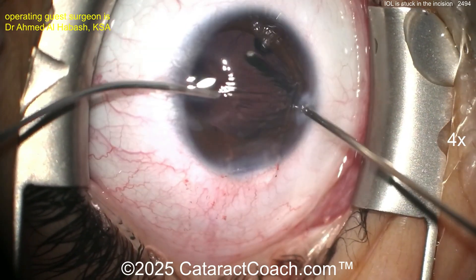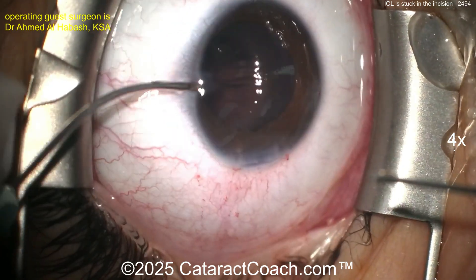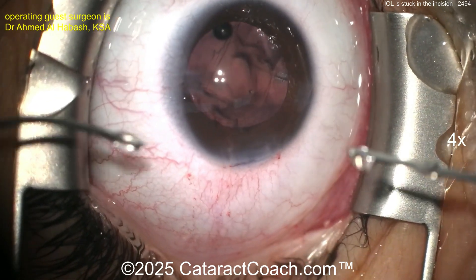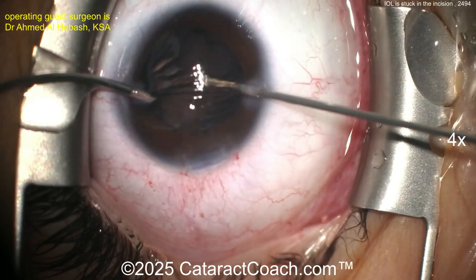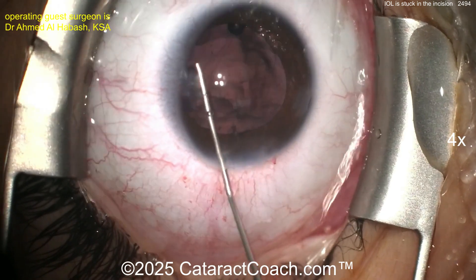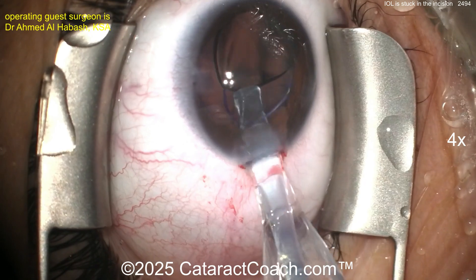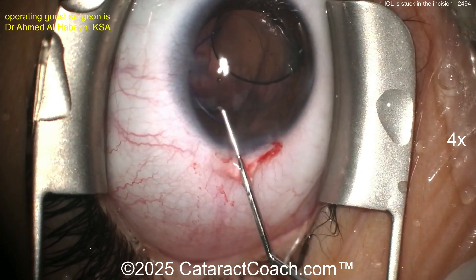Cleaning up the prolapsed vitreous should be relatively straightforward. I'd say putting in a three-piece lens is your best bet — put the haptics in the sulcus and do optic capture. You've got a beautiful capsule rhexis, so that's the saving grace here. Take your time. Triamcinolone is really helpful here to stain any vitreous and confirm there's none left in the anterior segment. Now here comes the three-piece lens — it goes in very easily, haptics in the sulcus, optic capture.